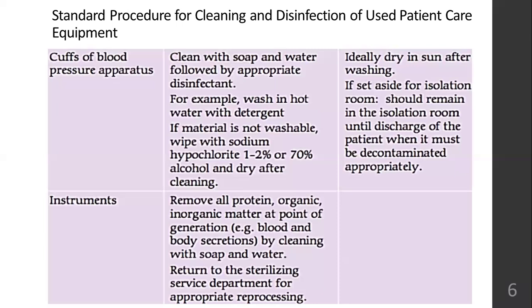And any other instruments like artery forceps, mosquito forceps, okay, tongs and all that you have used for patient care. Any organic, inorganic matter which is present on that instrument has to be removed either with automated washers or manual cleaning. Decontamination has to be done. Okay, blood, body secretion, if it is stuck to this instrument, that has to be cleaned with soap and water. Then it will be sent to the CSSD for sterilization.